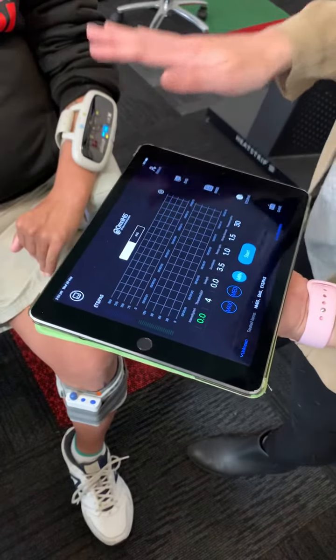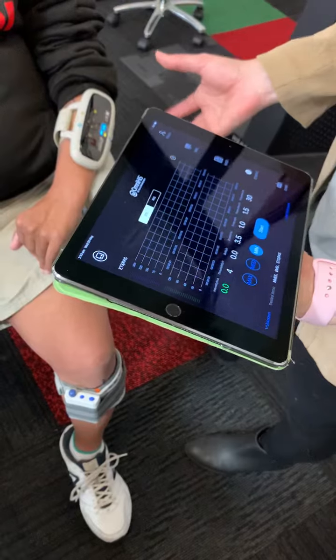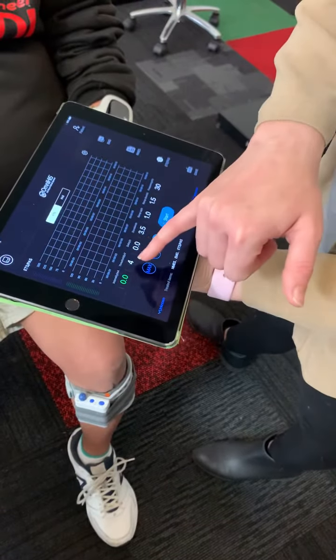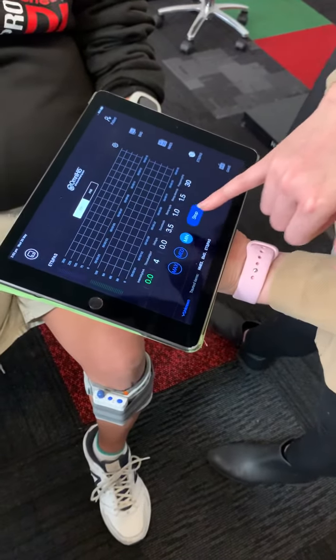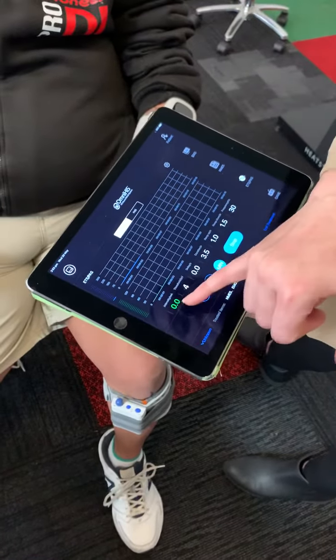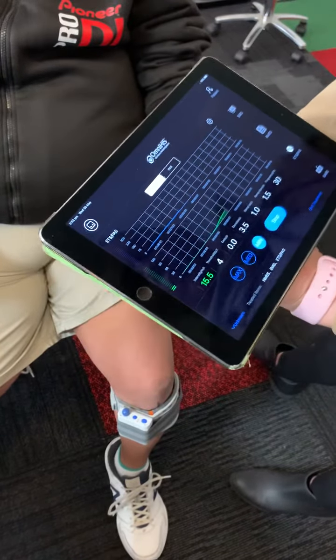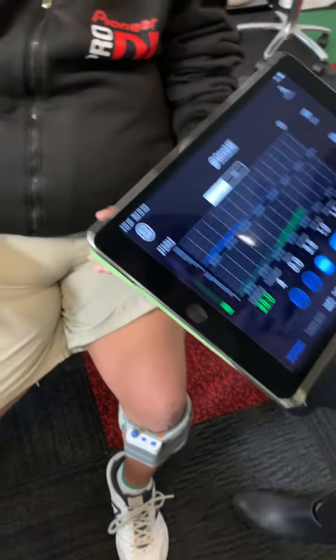So it's not timed, it's not on a program — it's Junior who's going to produce the movement. I've just brought the threshold down and I'm going to press start. Junior's sitting at about 28 in terms of the intensity, so we're going to go all the way up to 28 straight away, and you'll see Junior's hands start to move and open.